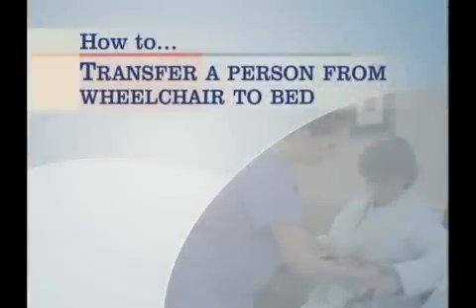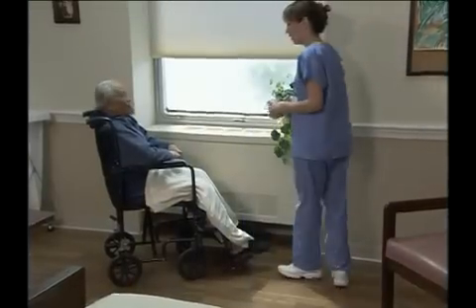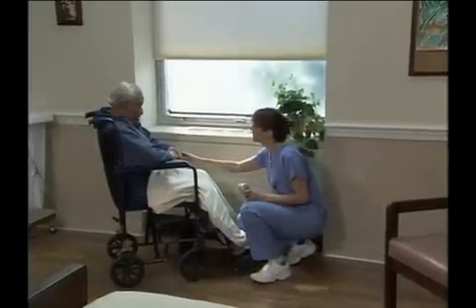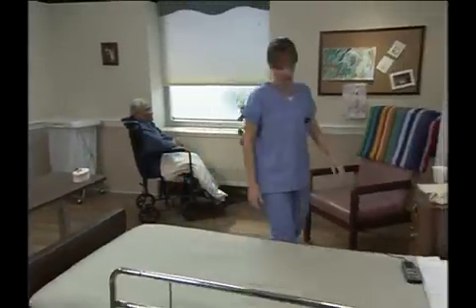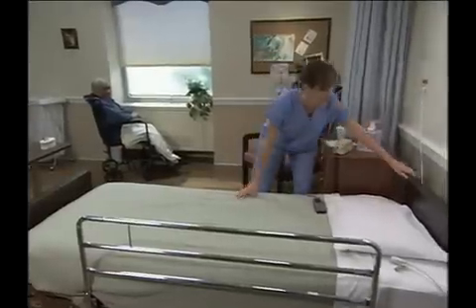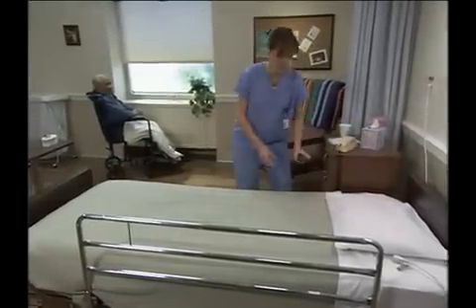To transfer a person from a wheelchair back to his bed by yourself and using a transfer belt, begin as usual by gathering your supplies, which in this case is a transfer belt. For safety, make sure the bed is lowered to its lowest position. Make sure the bed's wheels are locked for safety.